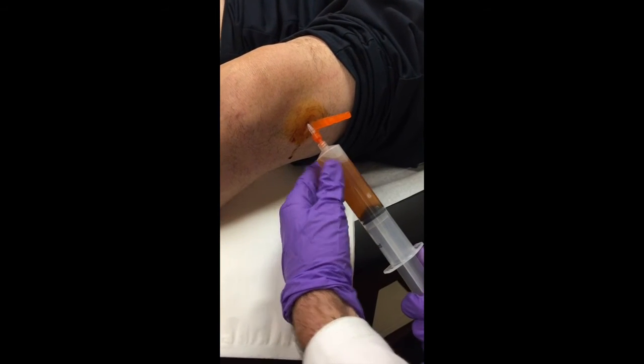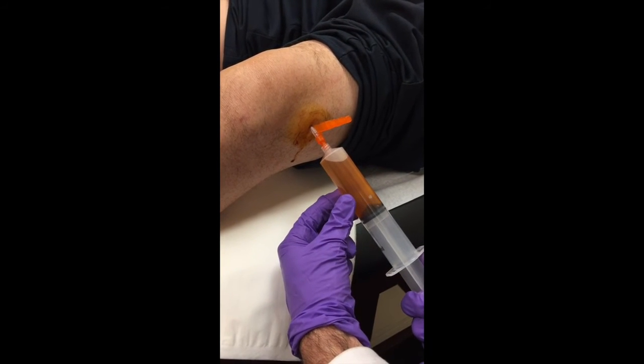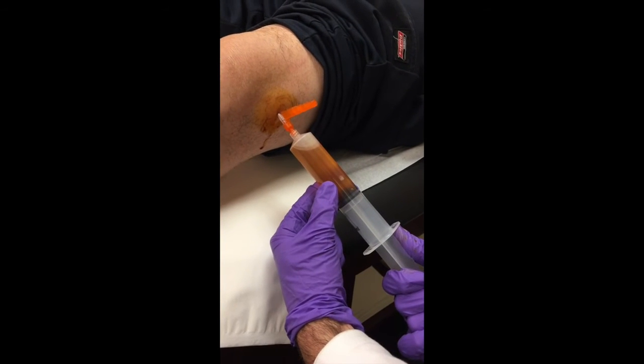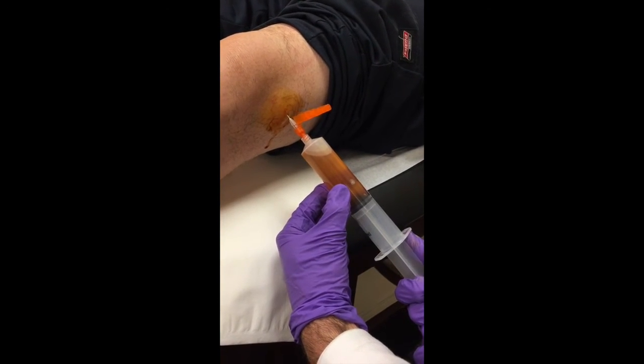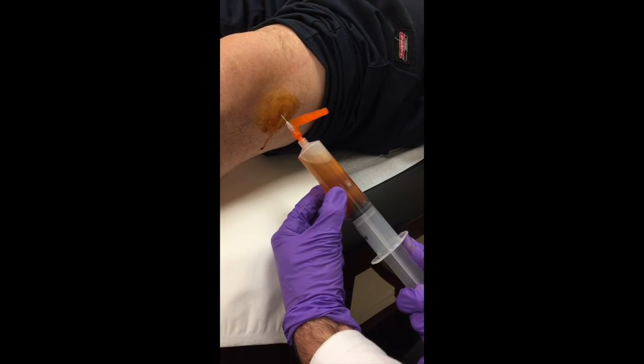Now I'm creating pressure but not getting any bounce back, so what I'm going to do is create constant pressure with my right hand pulling the syringe back, slowly pull the needle back, and see if I can get a flash of fluid. If I can't get a flash of fluid — and there's our flash.